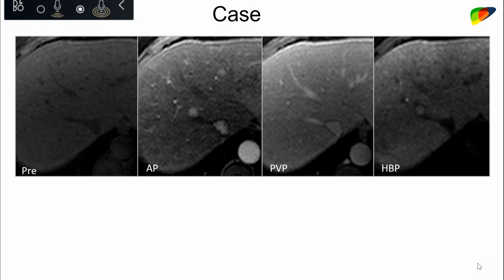Either in the body of the report, if it's truly a distinctive nodule, meaning I just see one of them, then I may describe it, but I don't put it into the impression. If they're multiple, I won't even bother describing them.